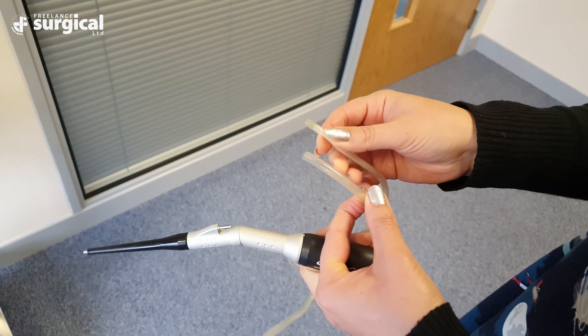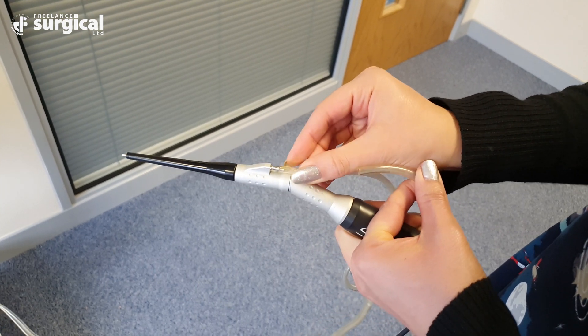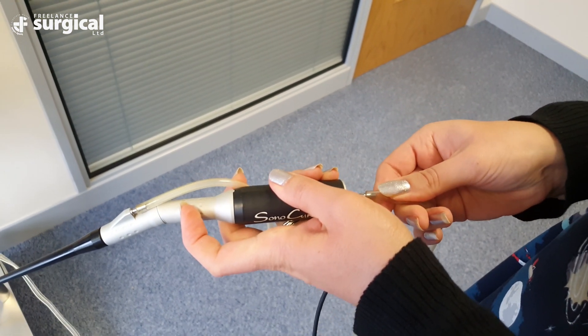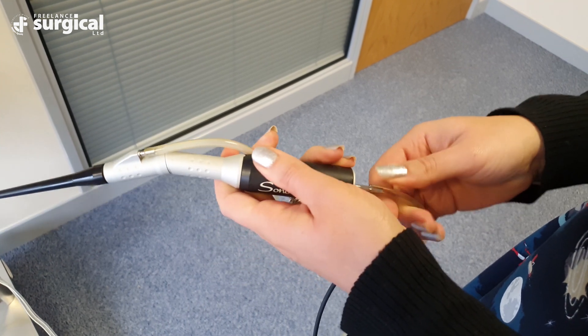The two remaining patient tubes can now be connected into the handpiece. The large diameter suction lumen attaches onto the back of the handpiece and the small diameter lumen, which is a fluid lumen, attaches onto the fluid guard connector.